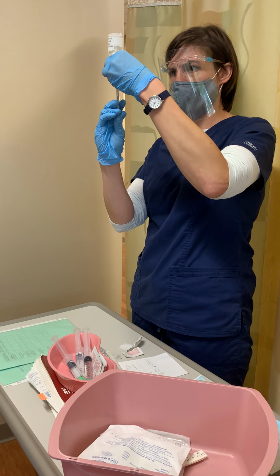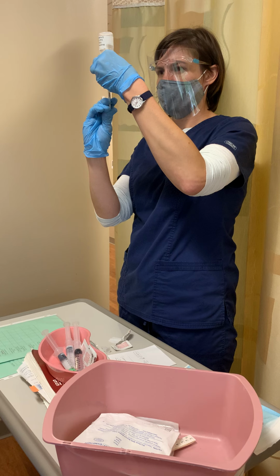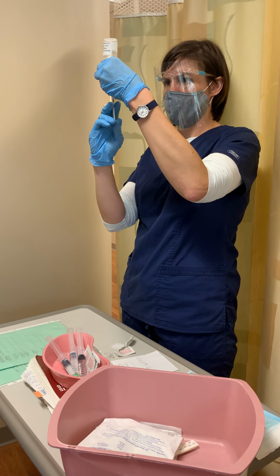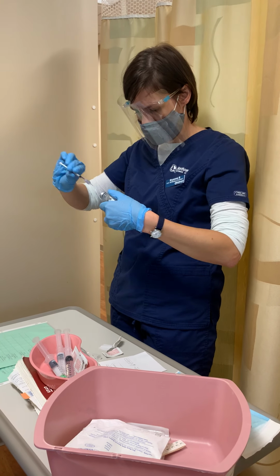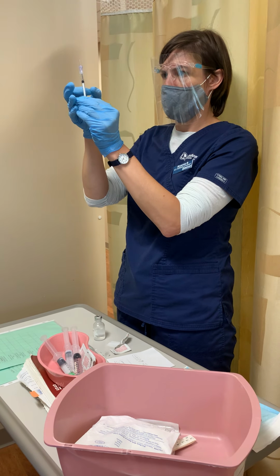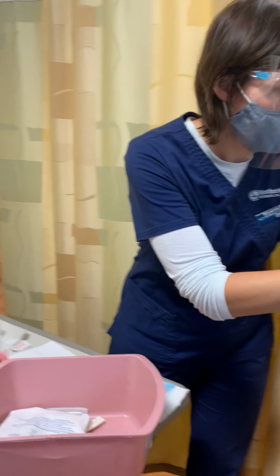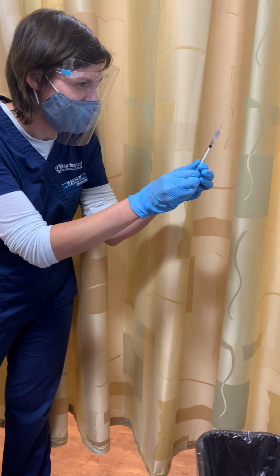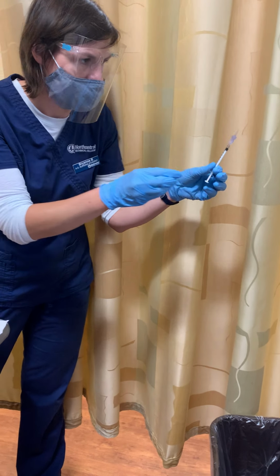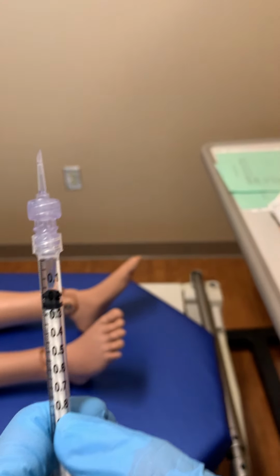Make sure as many air bubbles are out as I can. Getting all those bubbles out. Okay, so I am at 0.2 for my morphine.